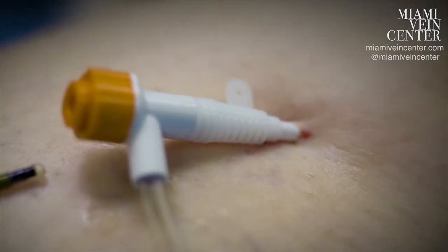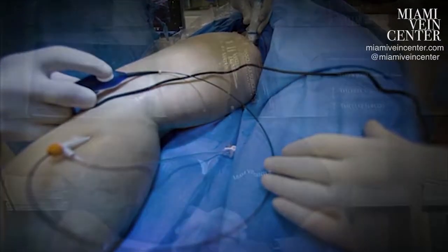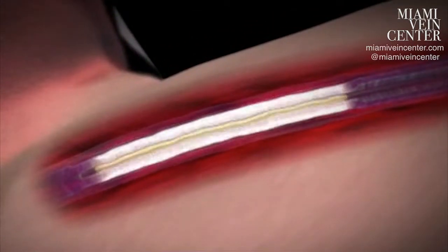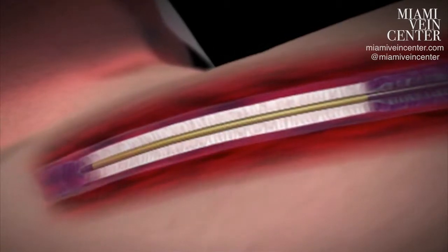So just like laser ablation of the great saphenous vein, radiofrequency ablation is a catheter that's inserted inside of the great saphenous vein. Usually we will enter the vein down by the knee with a needle and insert this catheter up the vein towards the groin. After the catheter is positioned, we surround the vein with local anesthesia, therefore numbing up the vein and making it a painless procedure. When the radiofrequency generator is activated, it delivers radiofrequency energy to the vein, which basically causes heating of the vein. And as we withdraw the catheter from groin to knee, that vein slowly seals closed.